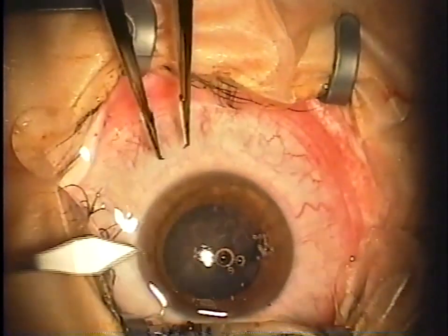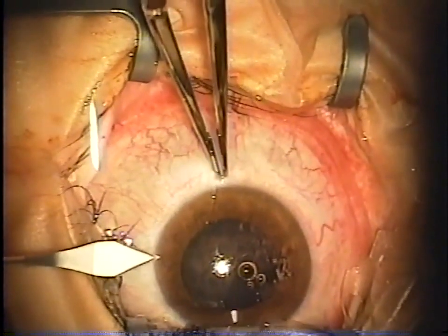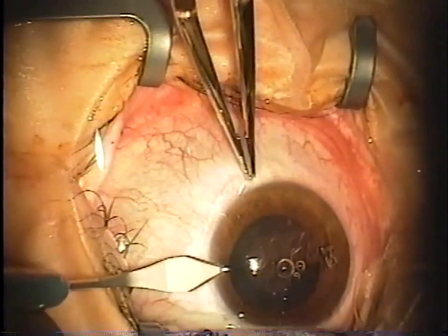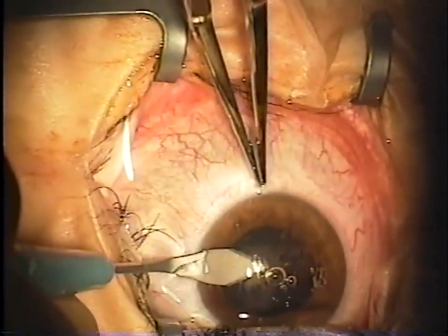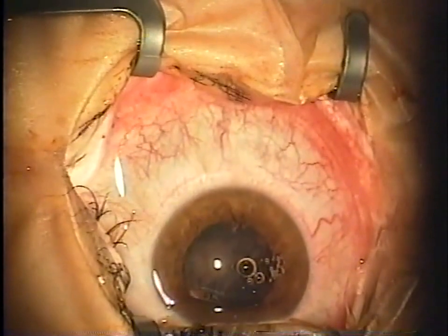And here we're using a 2.4 blade to make a tunneled incision. You can use any blade you want. 2.4 happens to be what we have already in the OR. To implant the lens, you need somewhere around a 3.5 millimeter incision.